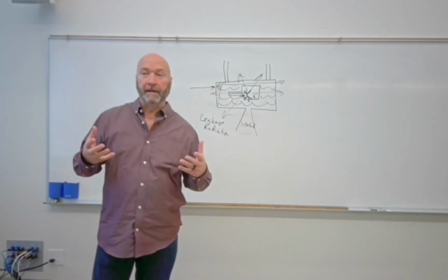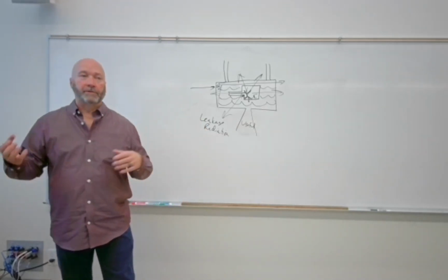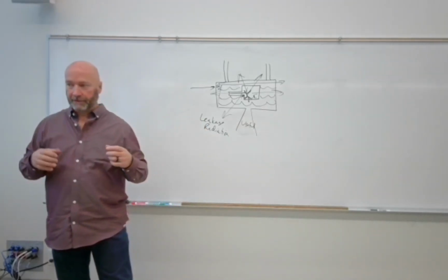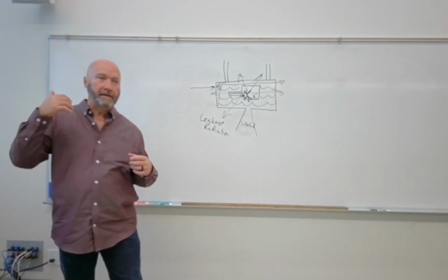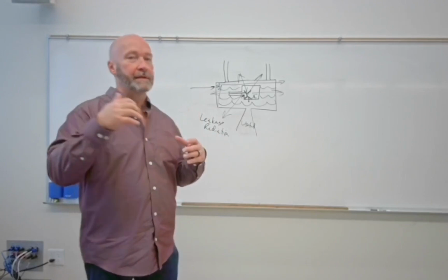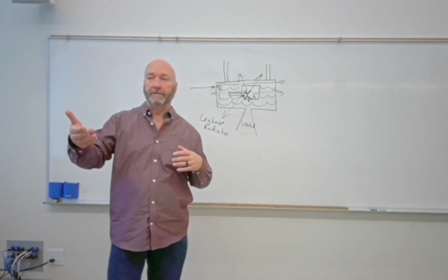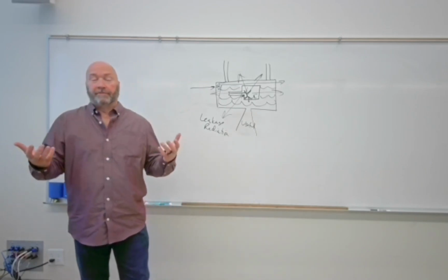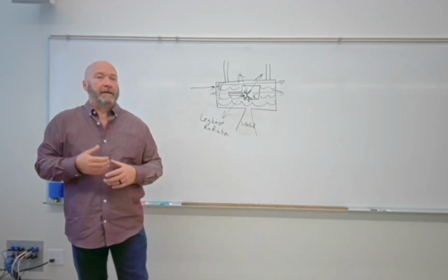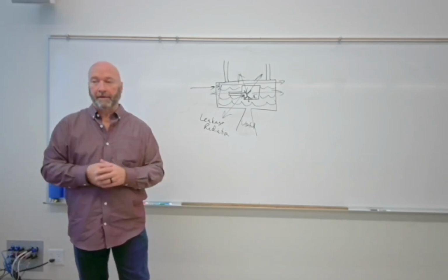But the purpose for that glass is to hold a vacuum. Originally, they used partially pressurized X-ray tubes, and the molecules inside that pressurization interfered with the travel of the electrons from cathode to anode. So they started using a vacuum tube, and the X-ray production increased and it got better.